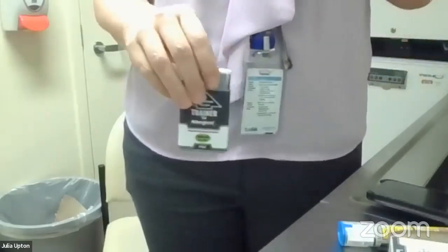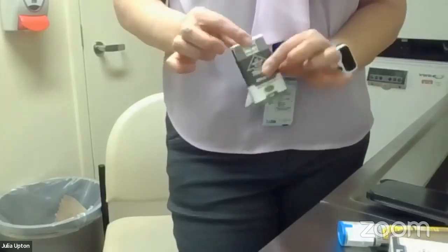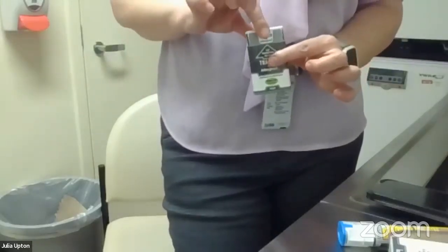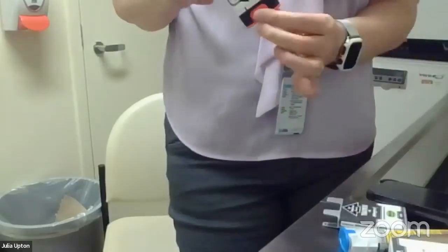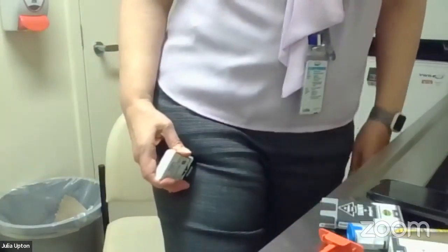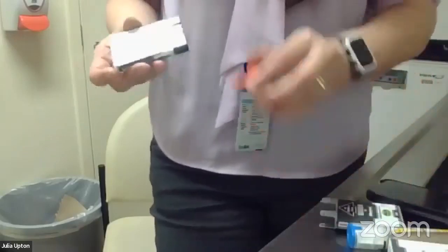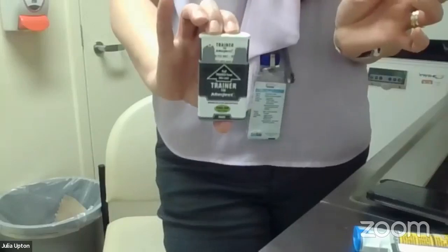So now it's hard to talk over this one, but I'll just tell you a few things. You saw it's really the same. The location is the same. The real difference is that it talks. If you know how to use it, you don't need to wait for all of that. So I'll just show you that if you knew how, you could just take it out, take the red off, and then outer thigh. 5, 4, 3, 2, 1. Injection complete. So it still talks a bit because it's reused for training purposes. Replace the red.